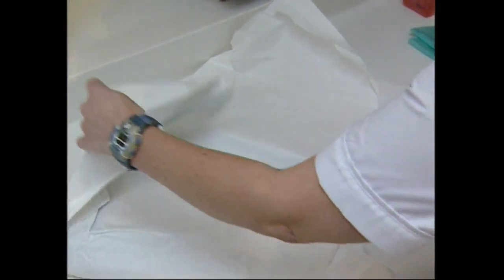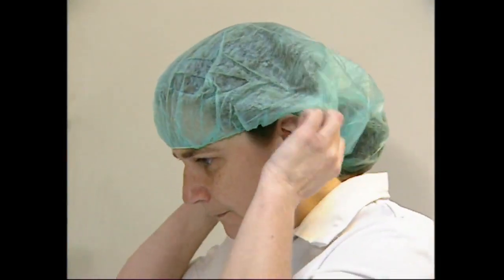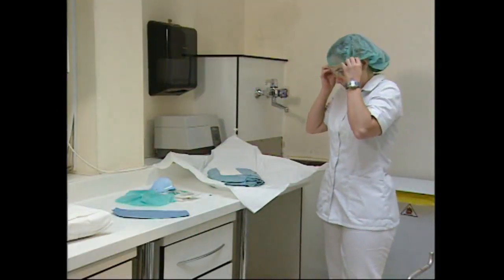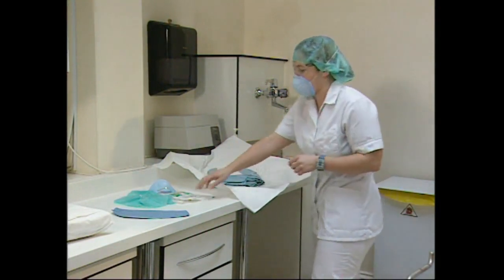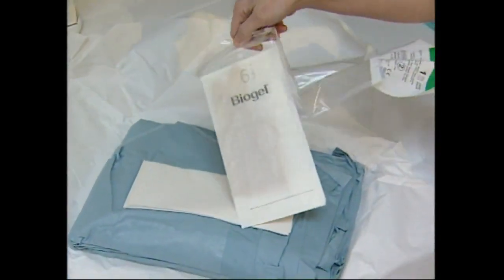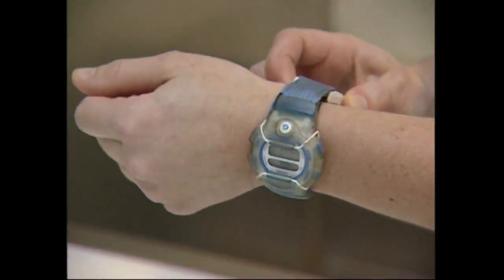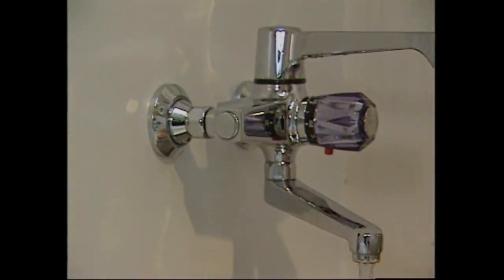The gowns pack is opened carefully by using the folded tags to prevent contamination of the sterile contents. The surgical assistant now prepares herself to work within the aseptic field that will be created. She begins by putting on her hat, protective glasses and mask to protect both herself and the patient from cross-contamination. The sterile gloves pack is opened and placed on the open gowns pack without touching the inner packet. All jewelry and watches must be removed from the fingers, hands and wrists. The surgical assistant will now begin to wash her hands.